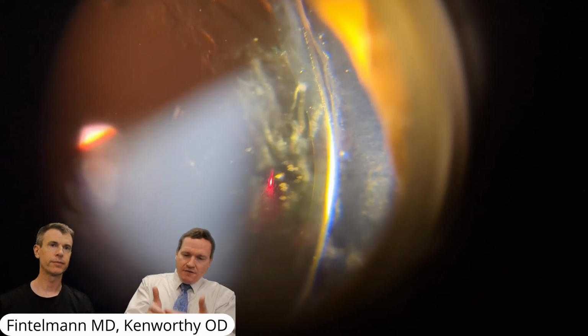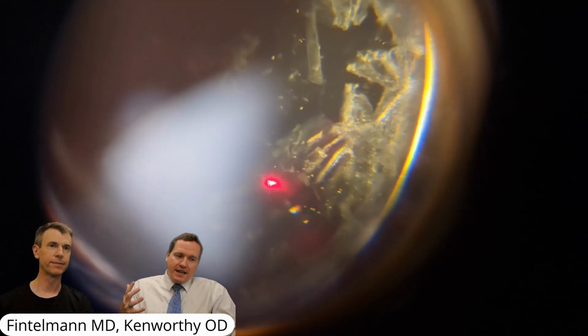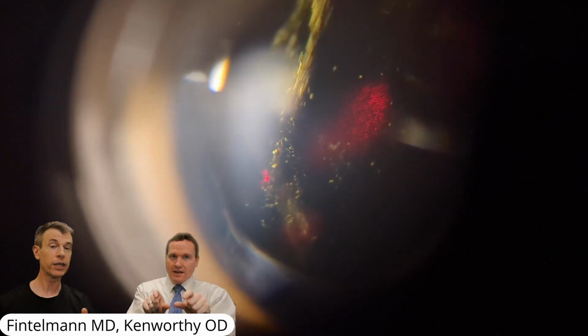But I would think if you do a YAG, you're going to blow out the back of the capsule, and PCO, these cells need some scaffolding to grow on. So when we say it's a recurrent PCO, is it making its own new scaffolding and going all the way to the central visual axis, or just peripheral? It can.